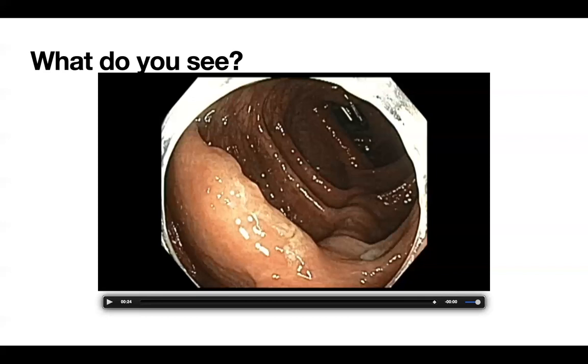So I tell them that I'm going to deal with this polyp. Usually most of these polyps that are sent are on the right side. Once you resect and take it out with a net or something, you can't see. And the second issue is that once you resect and close, you want those clips not to be detached because of a lot of air distension.